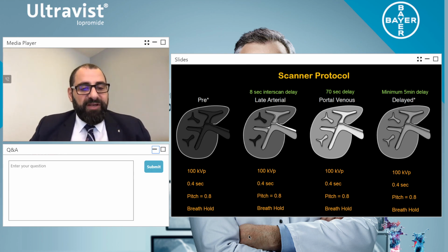Because when you do liver volumetry, they're taking the average density of the liver parenchyma. And so you don't want to show that there is liver perfusion deficit, like what we saw about 6 slides ago, which makes it difficult for surgeons to actually cut and decide, can we use this functional liver volume or not? And functional liver volume is determined by the difference in density. So this is where 370 density is a lot more important. And thank you, Gokaran. That was a fantastic question.